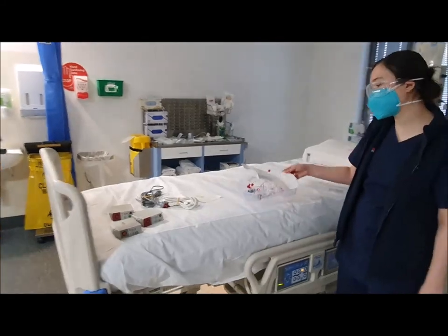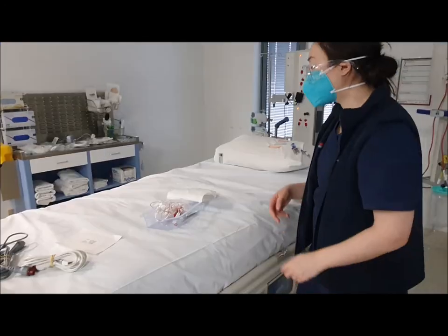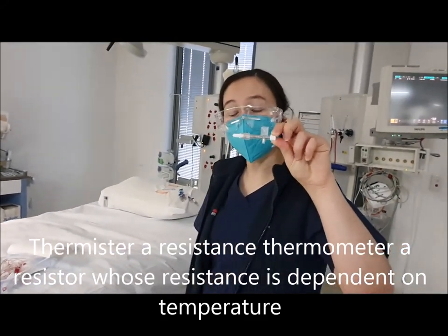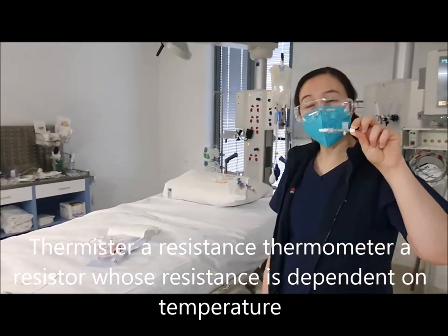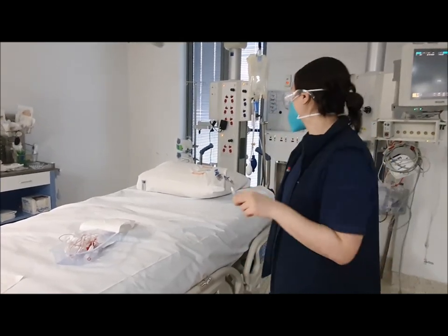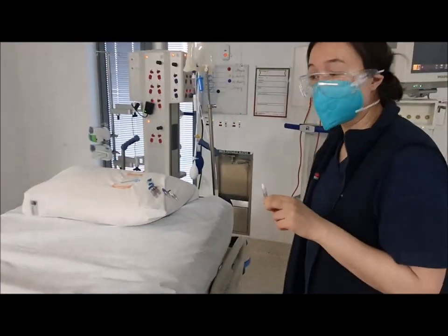We'll grab our Pico monitoring kit. Inside the package we've got a thermistor, which looks like this. This goes onto a central line — you will need a central line in order to do your Pico cardiac output studies. You cannot do Pico without a central line.